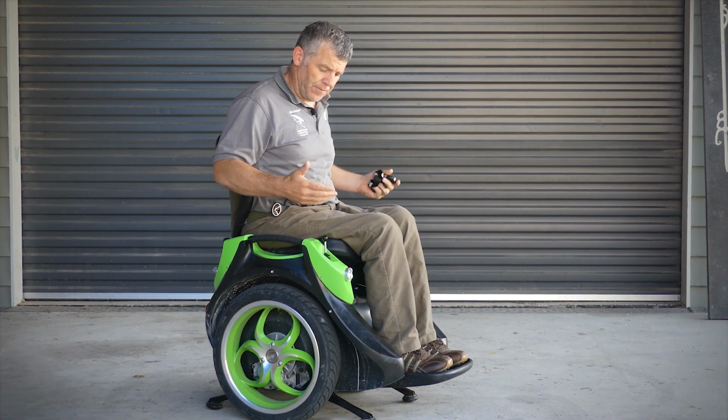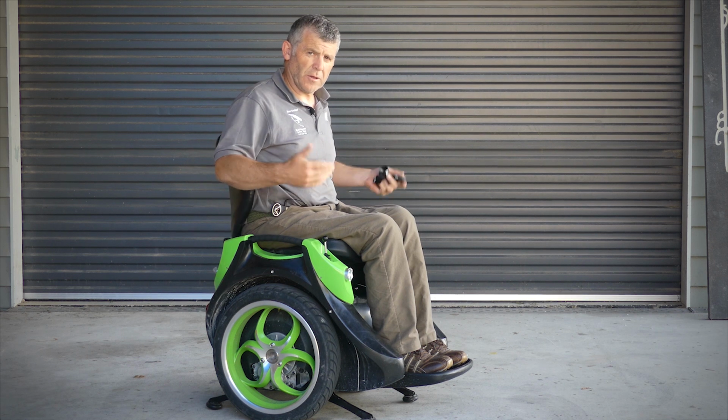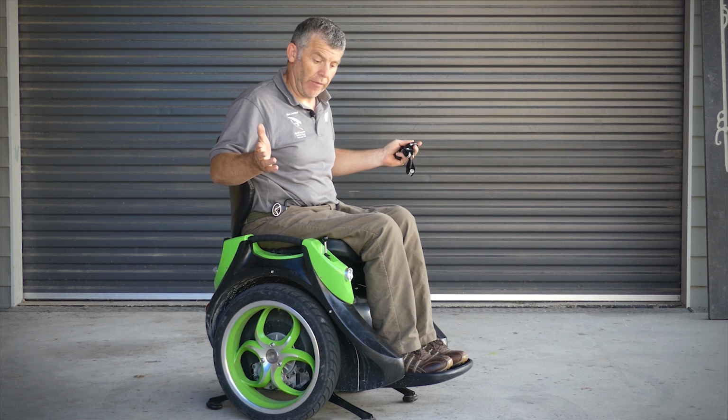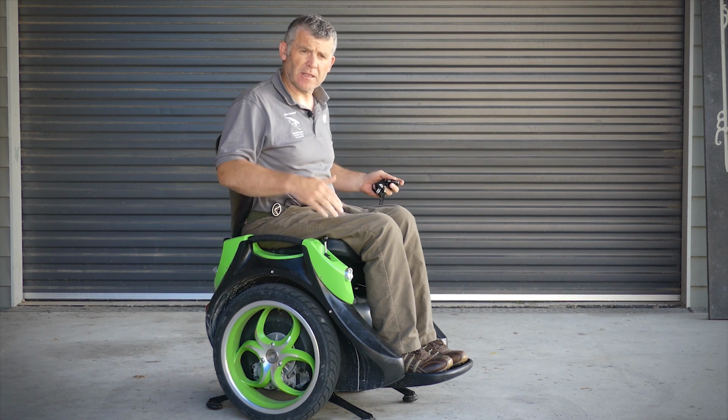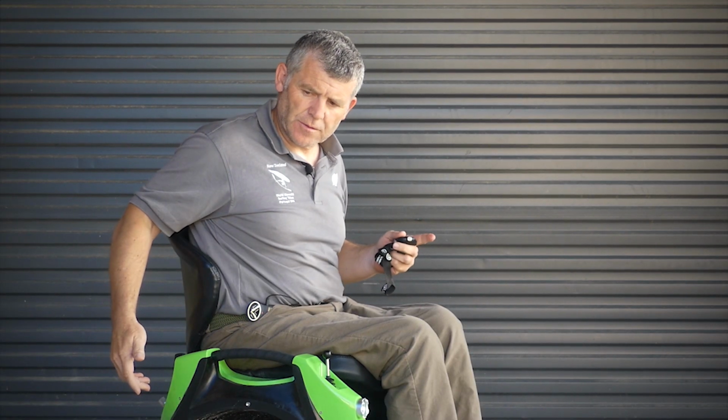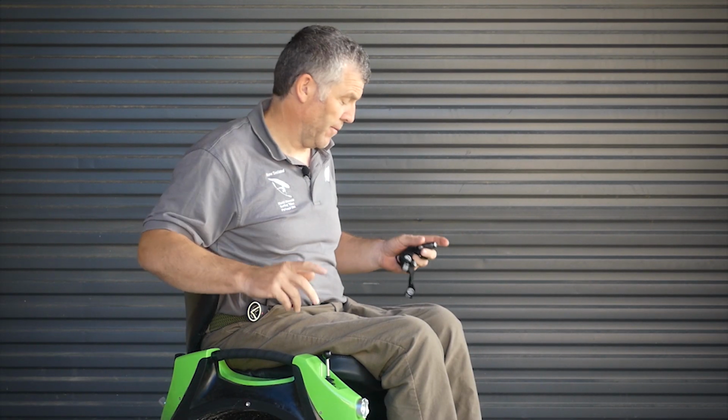Now I have no power on. If I was to put the legs up and ride, I could do this. I could ride and have the joystick available to me and get into the environment I want to. But if I switch back over to seat steer again, it will create another spin.